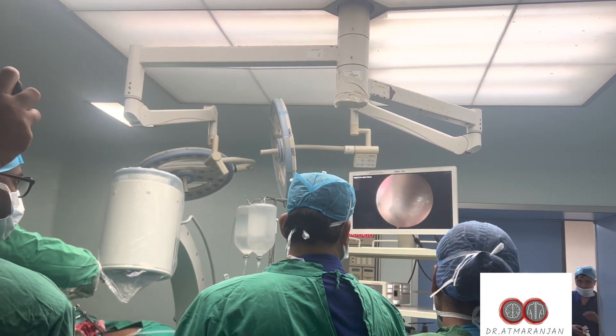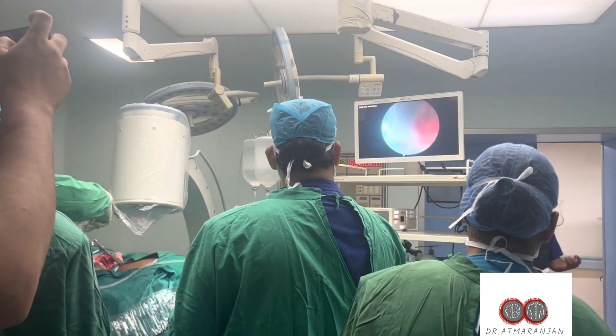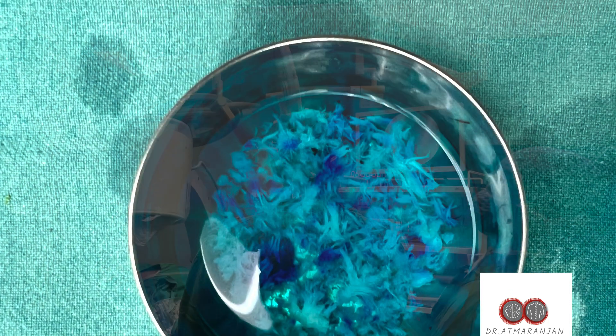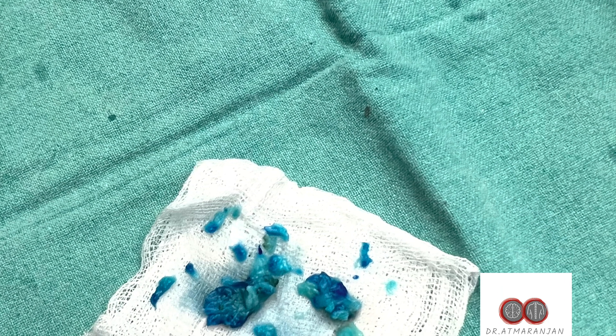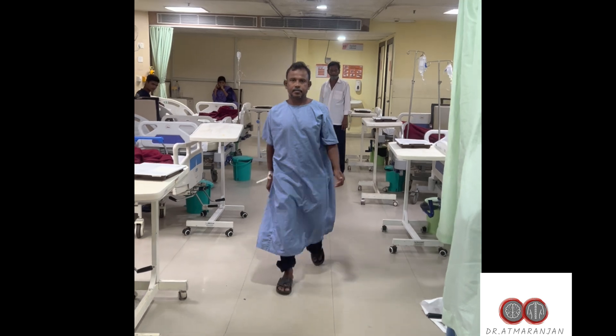The colored disc fragments, which have taken up the methylene blue dye, are clearly visualized. You can see the degenerated fragments have already been removed. All are degenerated fragments with an epithelialized cover, and the patient is able to walk within hours of surgery.